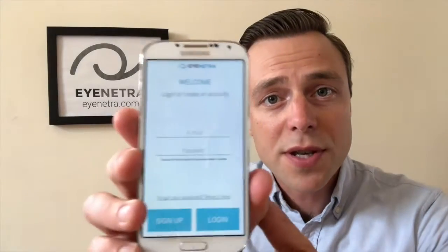The first time you open up your iNetra application, you will see a screen asking you to sign up for an iNetra account. You can do this quickly and easily by providing any valid email address as your username, then creating a password of your choosing and clicking sign up. Please note that for this initial sign-in process you will need Wi-Fi. However, Wi-Fi is not required to use the device to screen your patients.